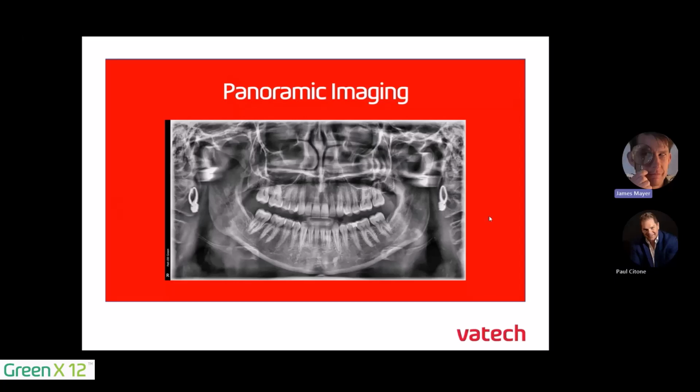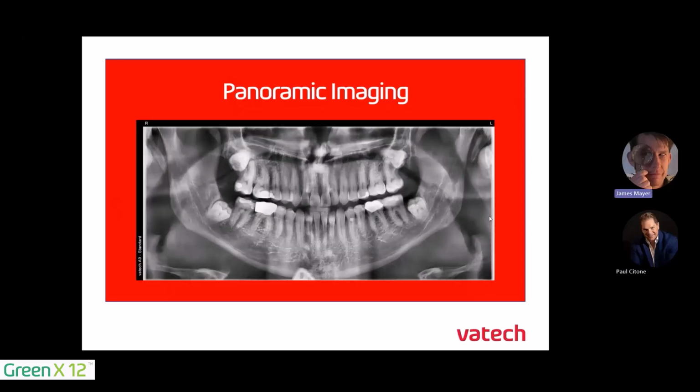Otherwise, beautiful pan. Let's look at one more before we conclude. What are you seeing here on this image? See that little white area on the bottom portion of the image, which is going to be the vest essentially creeping up on the back of the neck, causing that little white spot there.